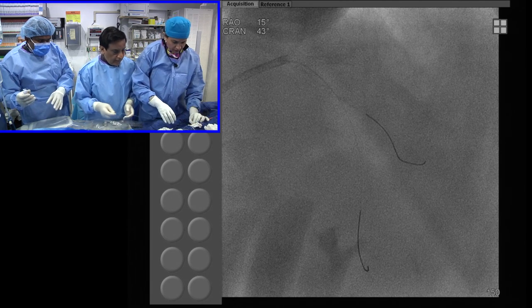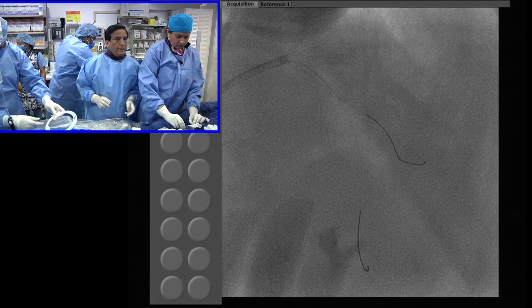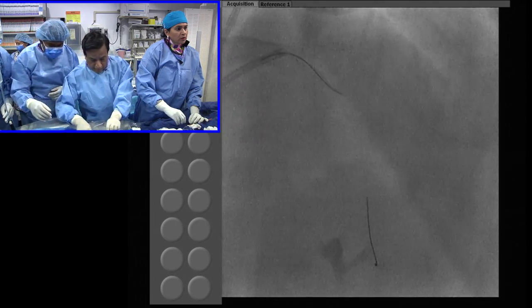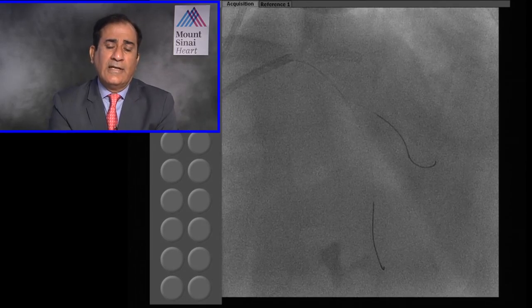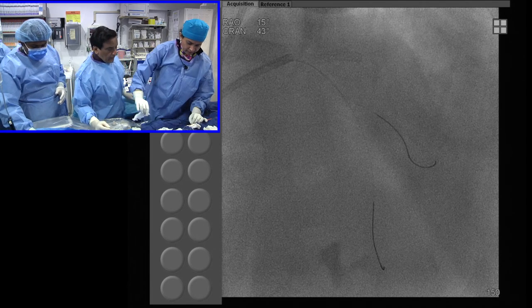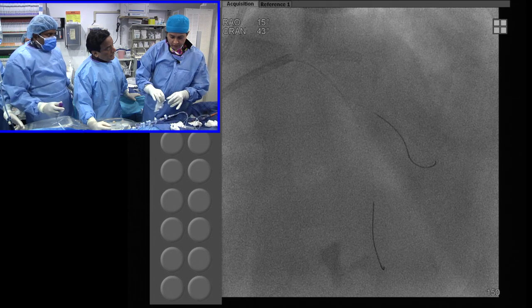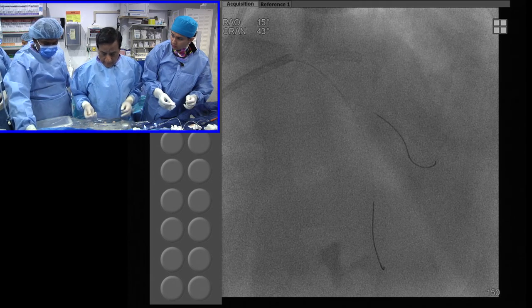Now the question is, should we change now to a ticagrelor or prasugrel after today? That's the only issue. No, but let me put first. You put a BVS distal before we put this bifurcation. I think do it later. Why would you want to change the dual antiplatelet? Because of the more complex, double-layer bifurcation lesion, that will be the one. No, but why don't we put one stent in the distal? You don't know how much overlap you'll have. Do it later on, so you can change the length, you know. Okay.